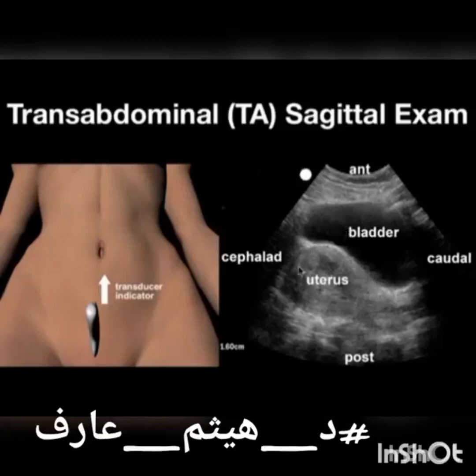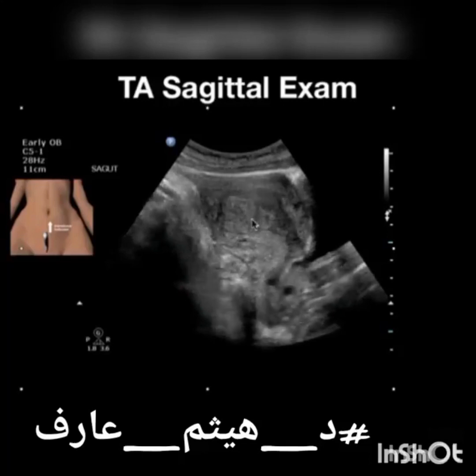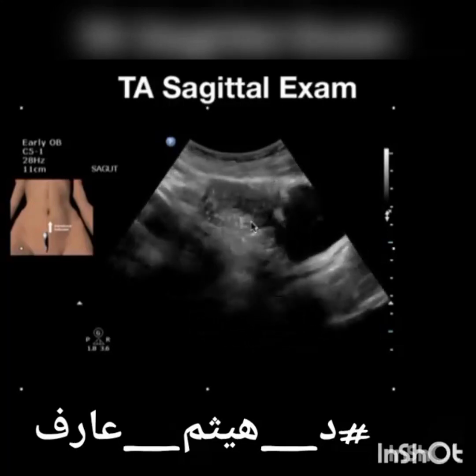Here you can see the uterus, which is anteverted. You can see the myometrium here, and you can see the hyperechoic endometrium here. This is going to be the posterior cul-de-sac, and this is going to wrap around here into the anterior cul-de-sac here. Down here you've got the cervix, and here you can see the vaginal stripe. Here's an example of a transabdominal sagittal exam where we sweep from side to side, surveying the entire uterus.